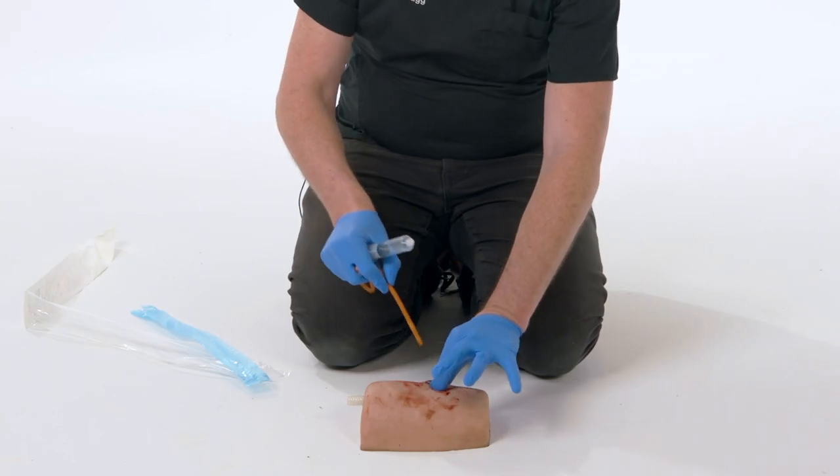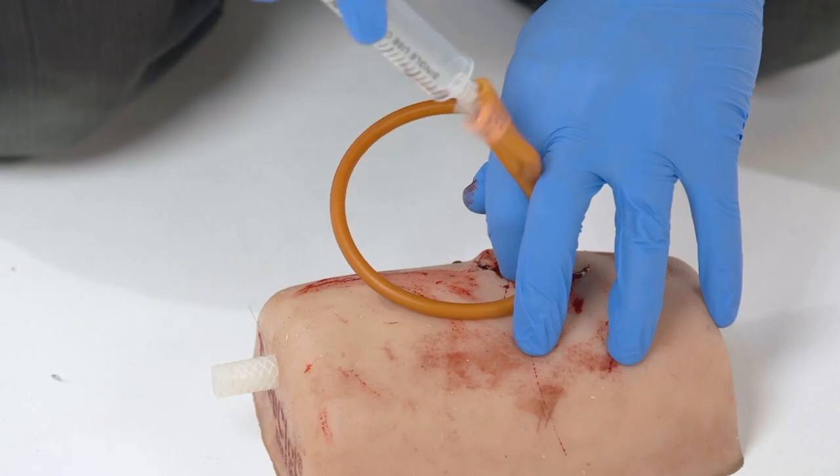We're going to open up the wound, put our sterile catheter in place and inflate the balloon.